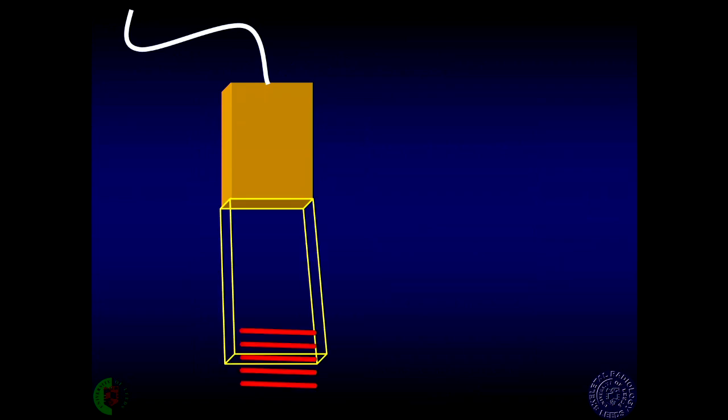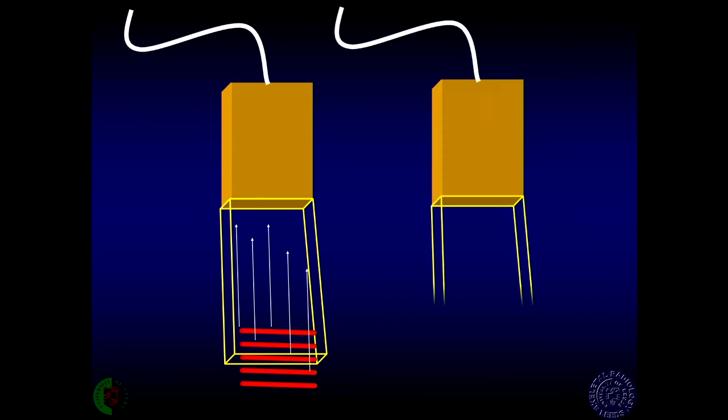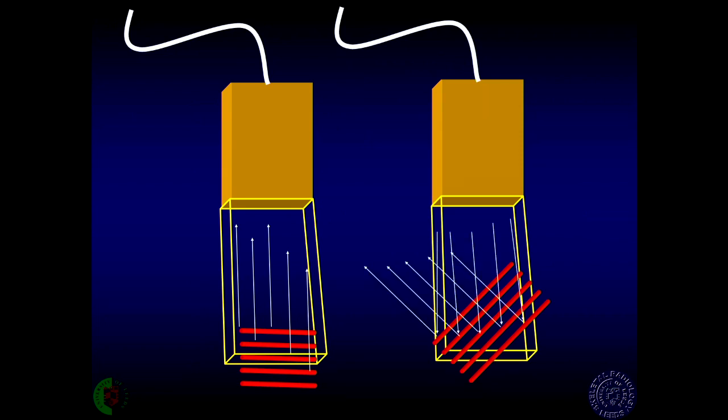So this is just a demonstration of anisotropy. What you're looking at is multiple parallel interfaces within the tissue of interest, and when these are aligned parallel to the surface of the transducer, you get a very good reflection of the sound back towards the probe, and hence a very strong, bright image. If they're not parallel, they tend to reflect the sound away from the probe, and then the tissue looks very hypoechoic, with a poor reflection seen at ultrasound imaging.